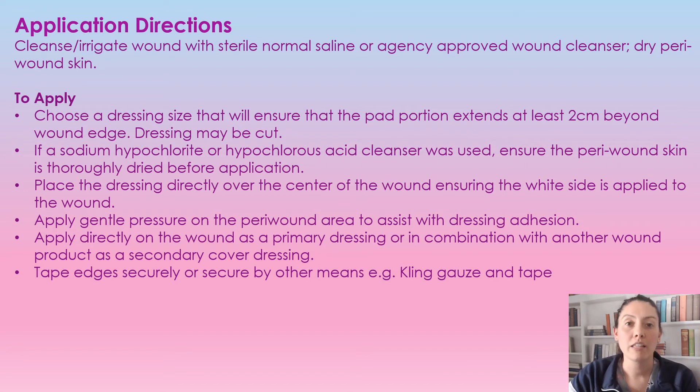When you go to apply this dressing, you're just going to center it over top of the wound and hold it down around the peri wound tissue to make sure that it does stick well. This can be used as a primary dressing or a secondary dressing in combination with another dressing if needed. You're just going to tape down the edges or secure it with cling.